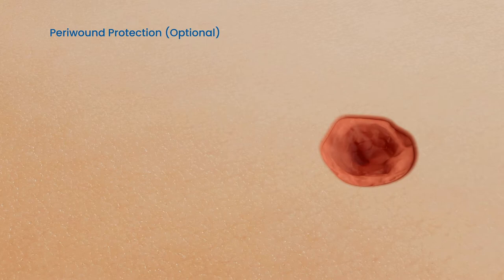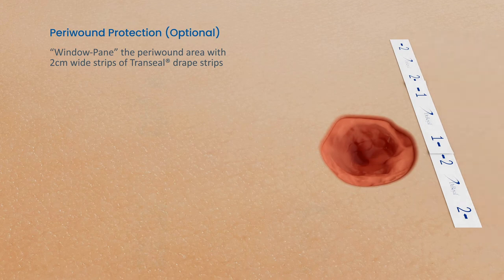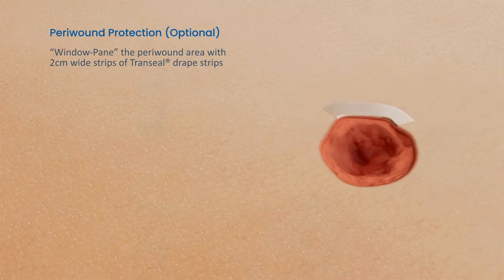If there are concerns of positional maceration or skin breakdown, protecting the peri-wound may be needed. To protect the peri-wound, cut the provided trans-sealed drape into 2 cm strips, ensuring you will have enough film remaining to cover and seal the wound. Window pane the peri-wound with the appropriate number of strips to cover exposed skin.